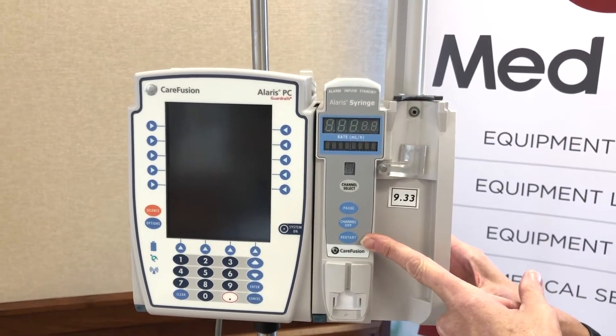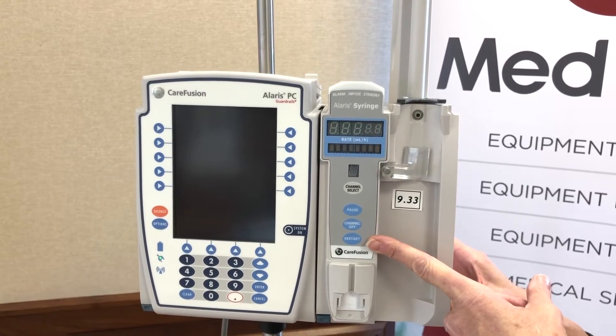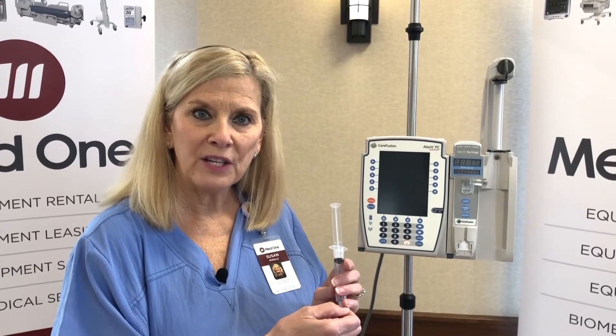Next we'll walk through choosing syringes, loading the syringe pump, and then a demonstration. The Alaris syringe pump module accepts multiple vendors' syringe sizes from 1 ml up to 60 ml — BD, Monoject, Terumo. Flow rates are as low as 0.01 for tiny premature babies all the way up to 999. Additionally, the tubing for the Alaris syringe pump module is not proprietary — you can use any tubing that will luer to the end of a syringe in any combination your hospital would want to use.